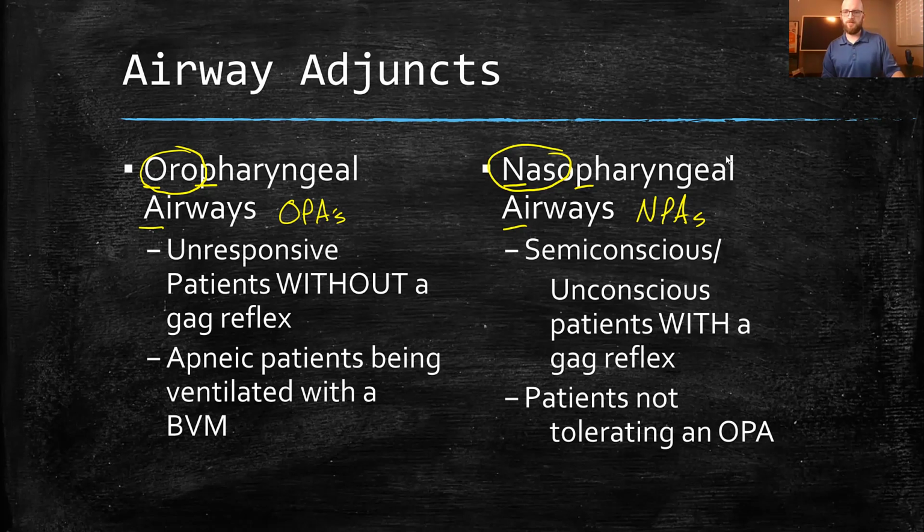That's another question: do you put one in, or one in both nostrils? Typically just one, if we can ventilate the oxygen through the one tube just fine. So we'll just put one in. We don't need one in both nostrils.